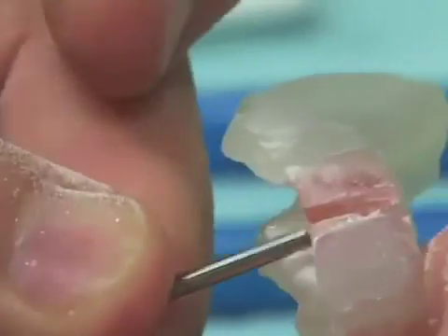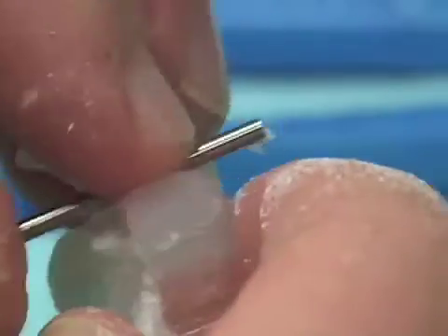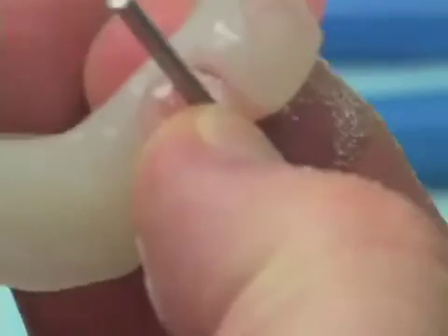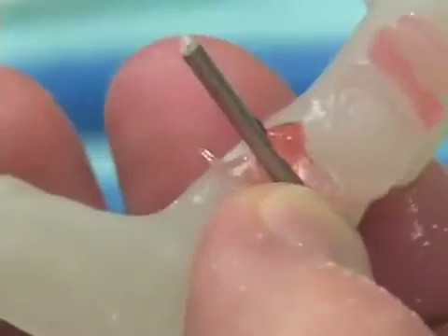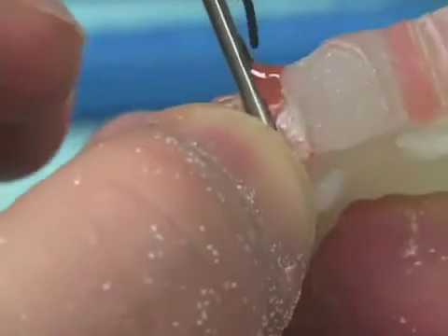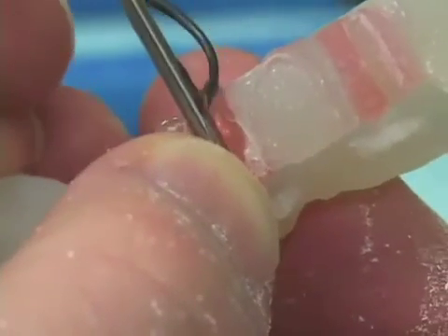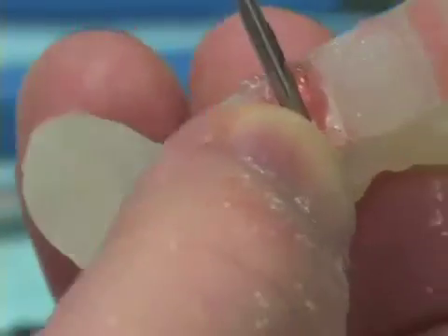So what I'm going to do is, when this is firmly held in the correct position, I'm going to add just a little bit more triad gel around this area at the lingual to get a little better surrounding of this. It takes very little triad material. Again, I'm going to take my large PKT instrument and just tease the area around here so I really get good coverage on that triad gel. And here again, I'm just going to cure that quickly for 20 seconds.